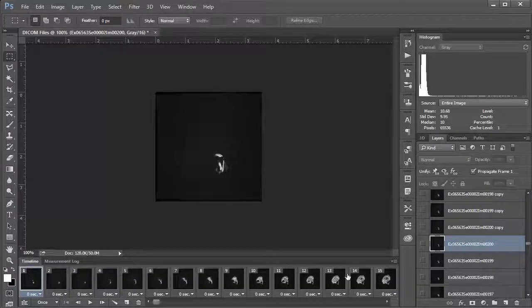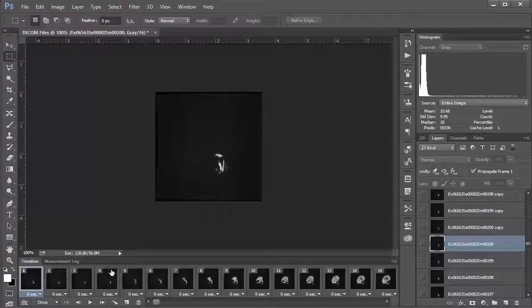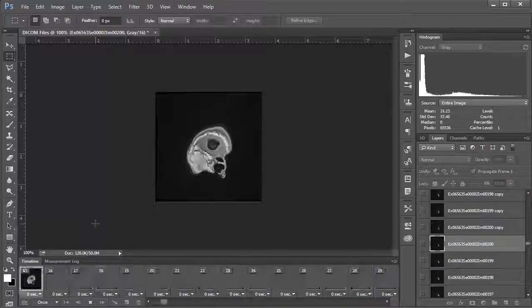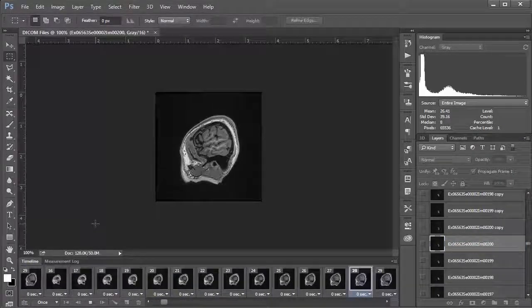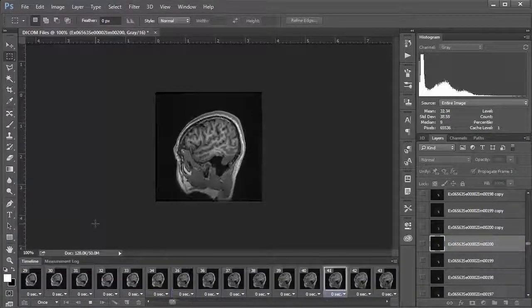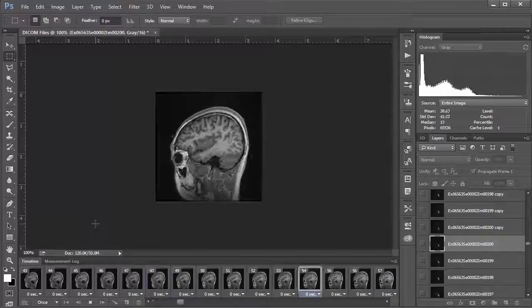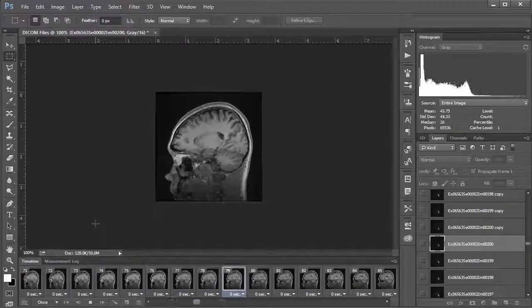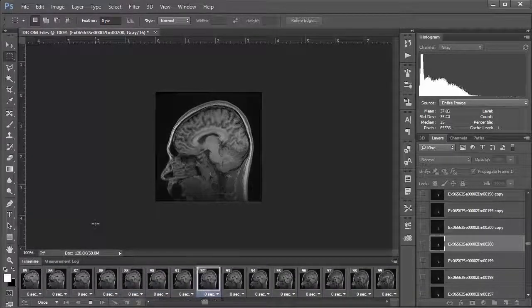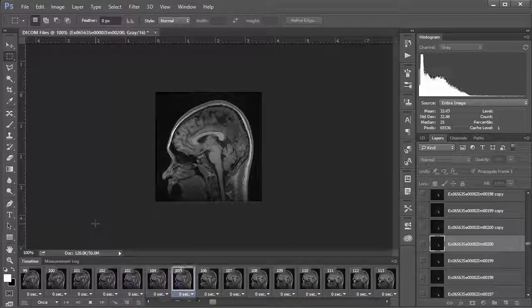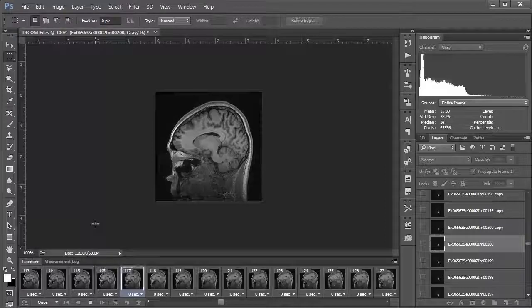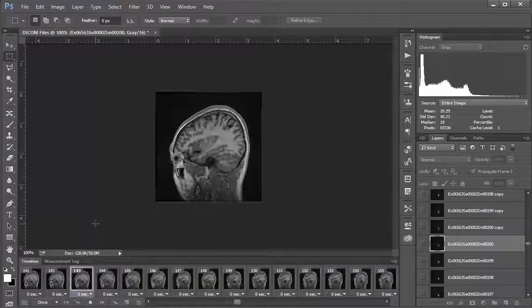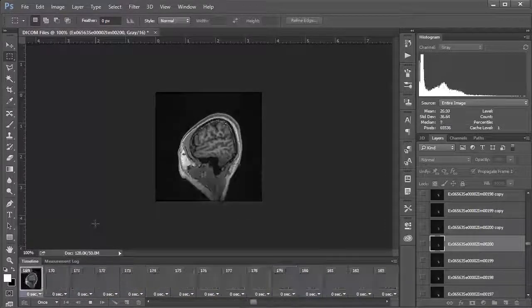We can see straight away if we click this play button here we've got our little animation. Let's just watch it sort of going all the way to the other side of the head. Maybe I'll put in some music here that'll make it a little more entertaining.